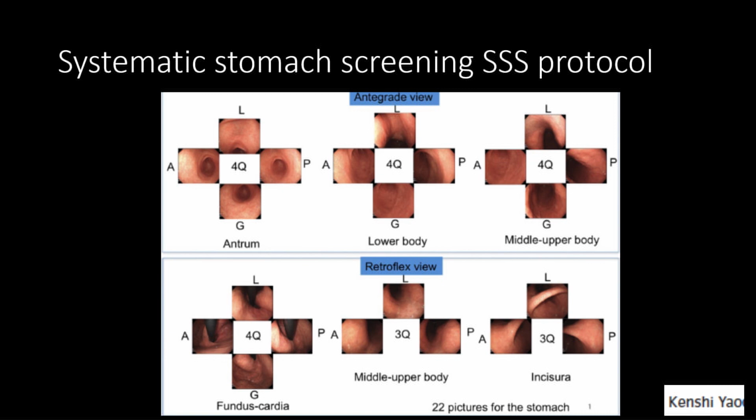Similarly with the esophagus, you have a look when you're going in, distend, have a look, and again when you're coming back, you have a look. A lot of us put on NBI when we are coming back: when we are going in, we use white light, and if we see nothing abnormal, when we are coming back we put on NBI to see if it looks normal. Next slide.